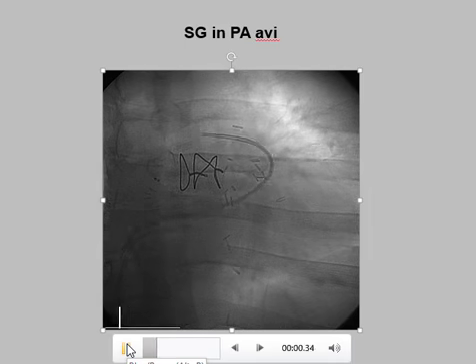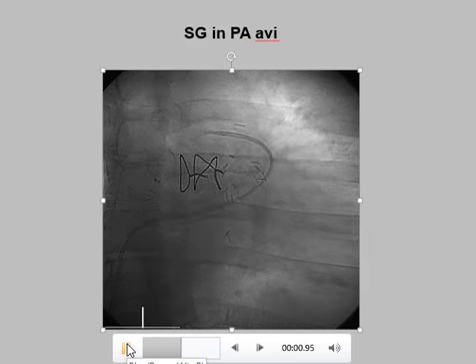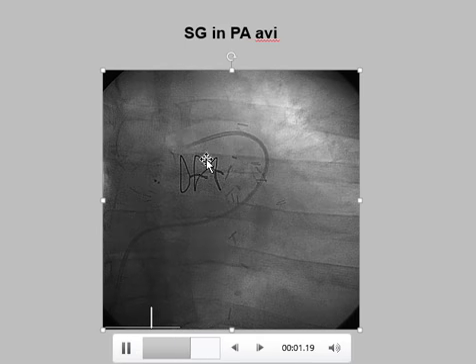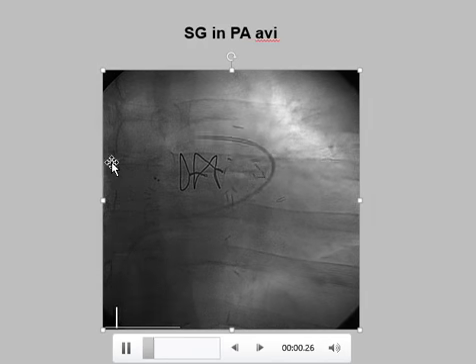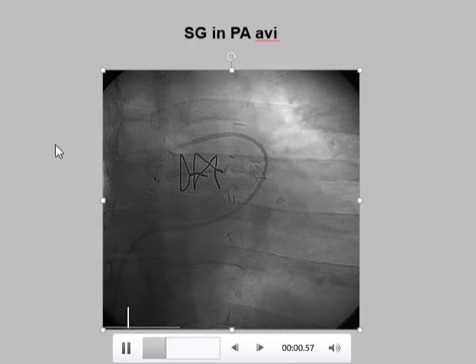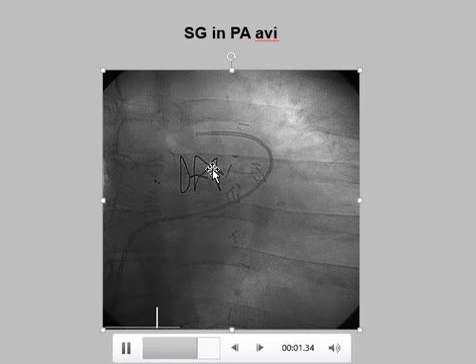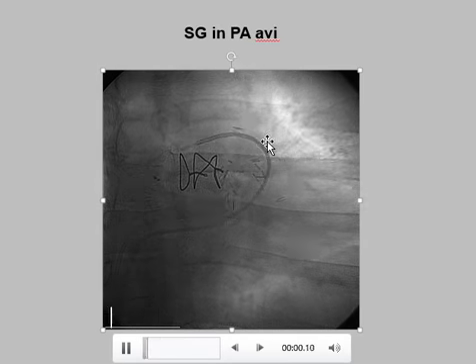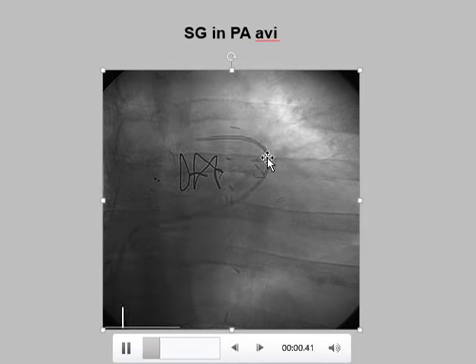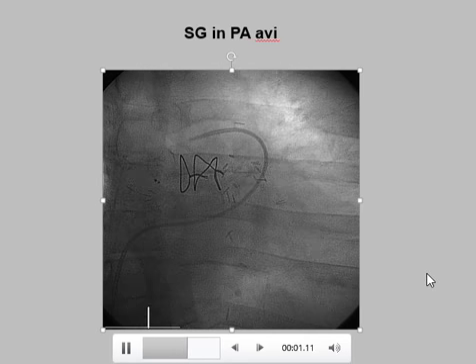This is just a brief shot of the Swan-Ganz in the pulmonary artery, where you can see it bouncing around. It's not lodged nicely, recording a reflected pressure from a retrograde transmission. It's bouncing around, so it's recording the pressure around it being transmitted forward. Right? So it's clearly identifiable, and you can see it's a good trace of a pulmonary artery, and you would record that.